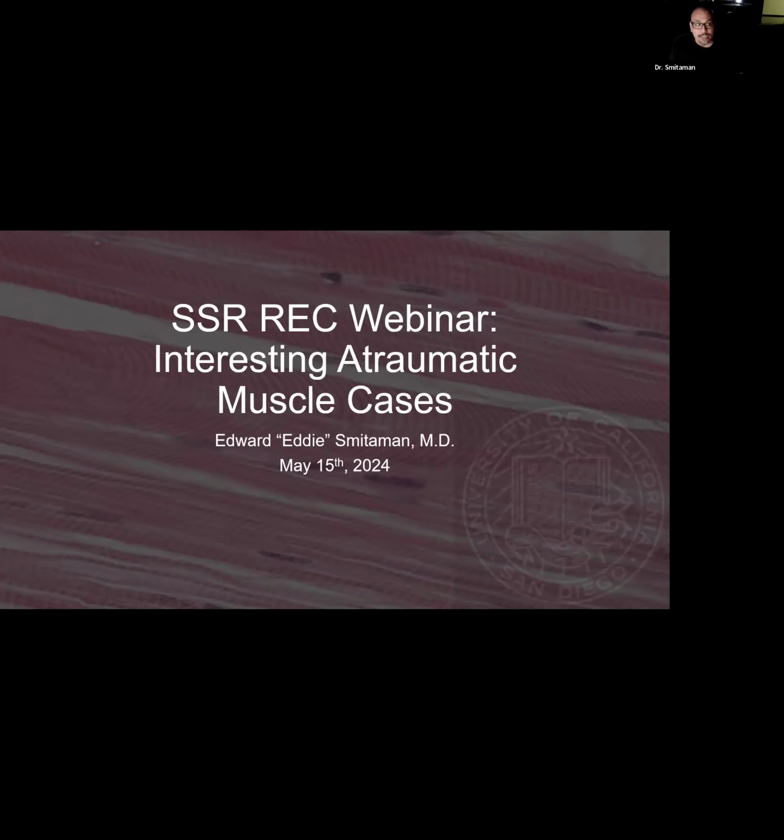These disorders share a lot of similar features on MRI, and it can be very challenging for us as radiologists, not only clinically but also pathologically, to differentiate and correctly diagnose them. So today I'm going to share a case-based approach to try to classify some of these muscle disorders to better assist our clinical colleagues and, obviously, to help patients.